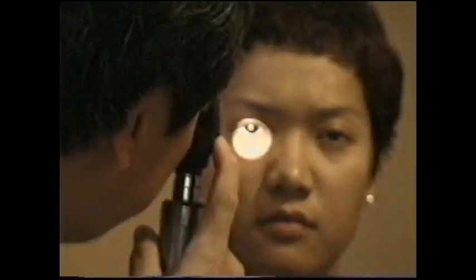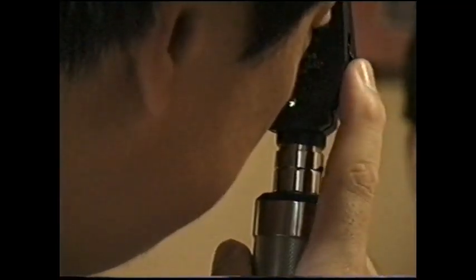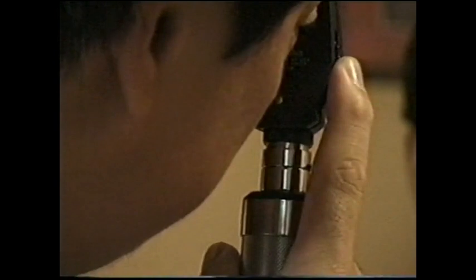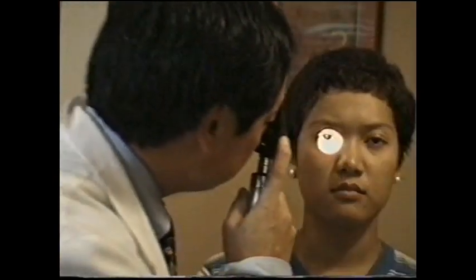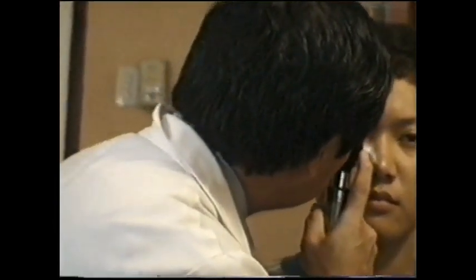Vascular color, caliber, bifurcations and crossings are noted, as well as hemorrhages and exudates. The macular area is always the last to be examined to avoid photophobia. Any abnormalities observed are noted. The entire procedure is repeated on the other eye.